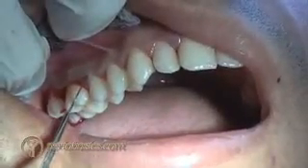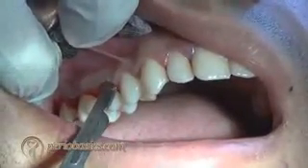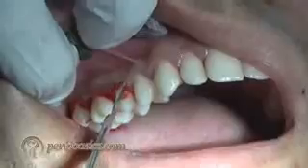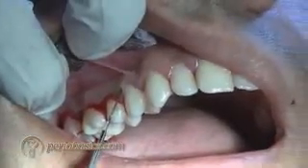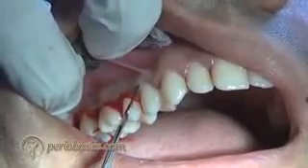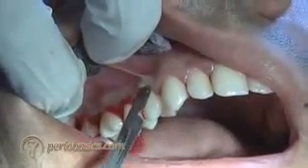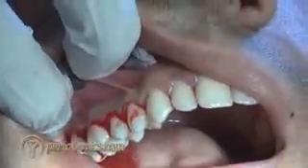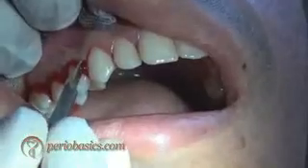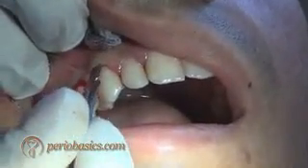You can increase or decrease the thickness of the incision according to the thickness of the gingiva in that area. You can see that I have given the internal bevel incision and I am increasing and decreasing the thickness of the incision according to the thickness of the gingiva. You can see that in canine area I have tried to reduce the thickness of the incision.